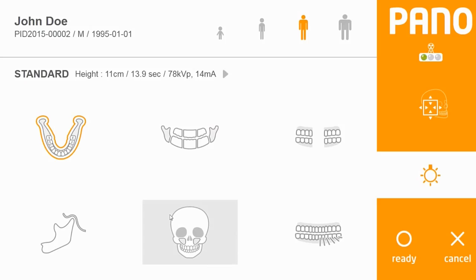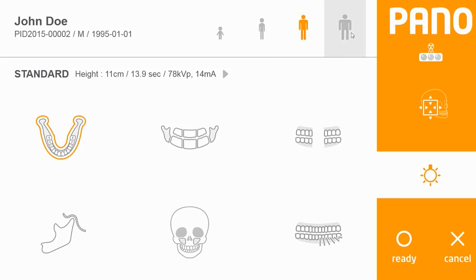You don't need to click reset after the previous acquisition. In this interface, the options include patient type, ranging from a child setting to small, medium, or large adult. The default is the medium adult patient once you enter the interface.